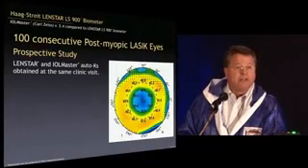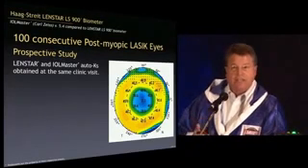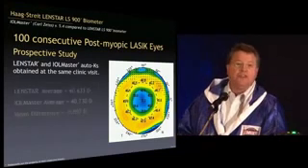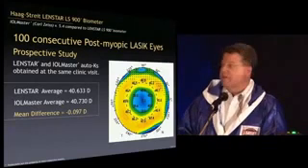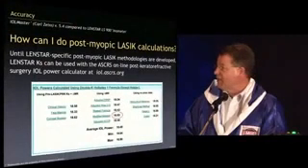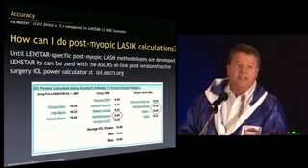What about prior keratofractive surgery? Well, because the Ks are basically the same, the spherical equivalent of Ks are the same all the way down to 30 or 29 diopters, you can also use the ASCRS calculator. And there's some work going on right now to have this auto-populate the ASCRS calculator for you. So there's our ASCRS calculator. And the methods that we like the most are modified Masket, Haigis-L, and the Shammas method.